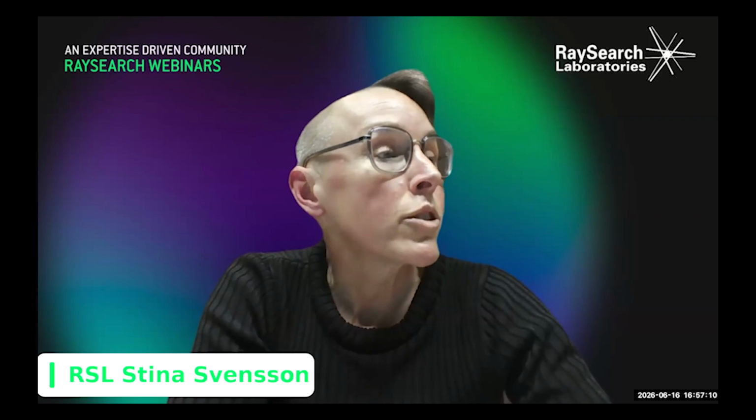So first, I want to ask Jakob and Rasmus, because based on the registration form that we had, and also the questions coming in the Q&A function, we see that there are a lot of concerns about handling of uncertainties in dose accumulation and deformable registration accuracy. And one thing that comes in is whether you can do this using rigid registration rather than deformable registration, and what you can do if you don't rely on the deformable registration in some regions.